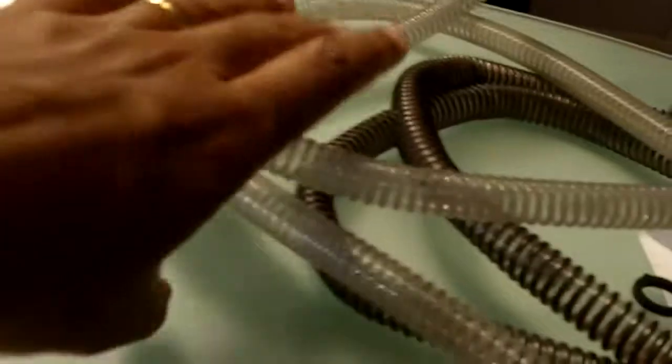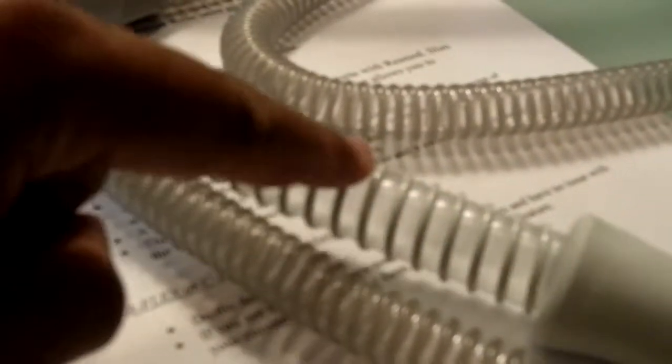As opposed to ResMed, what comes with it is a 15 millimeter diameter tubing. So you can see, this is ResMed, this is ResPronix, it's smaller.